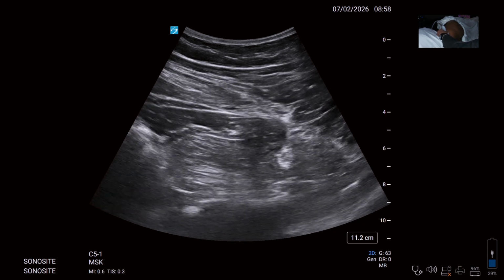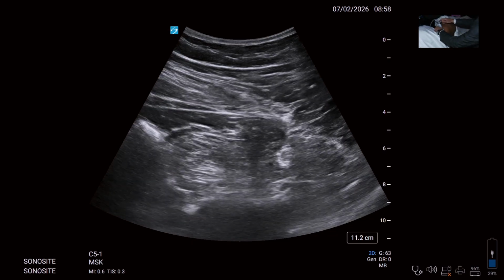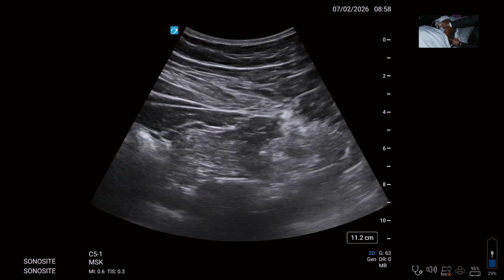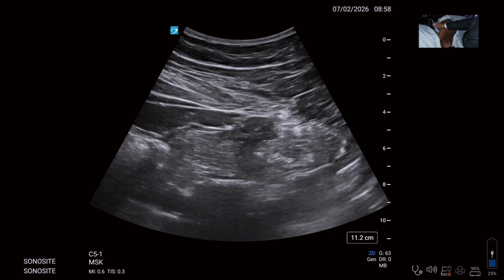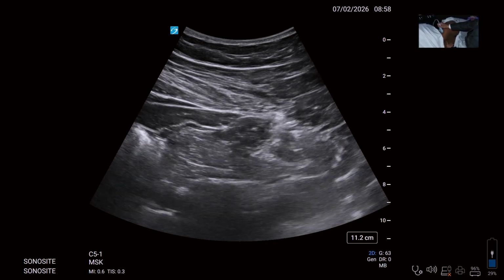आप इस तरफ focus करेंगे? हाँ, एक second. So my needle is going to come from this place. Can you see my needle trajectory? Manish, ऊपर वाला point करना. Picture in picture वाले में.